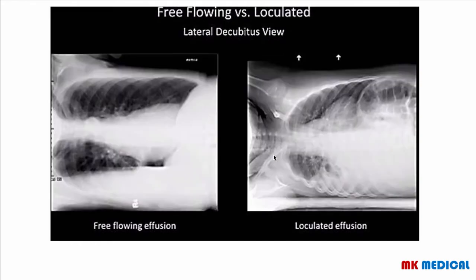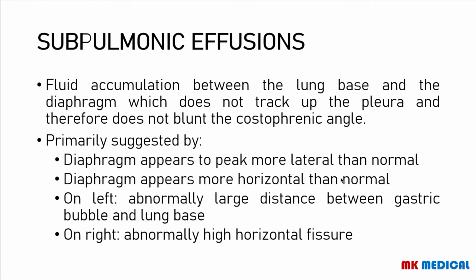Here is an example of free-flowing as well as loculated effusion in a lateral decubitus position. You can see that the fluid is flowing and distributing all over the zones of the lung in the free-flowing case, while in the loculated case it is still limited to one area. Sometimes you may have a sub-pulmonic effusion — this is accumulation of fluid between the lung base and the diaphragm, not tracking up the pleura and therefore not causing blunting of the costophrenic angle.